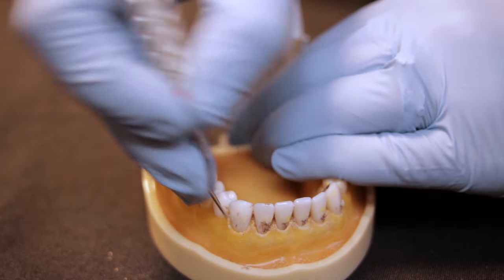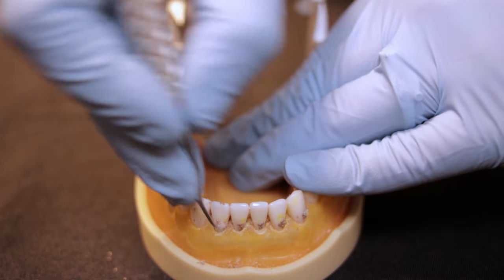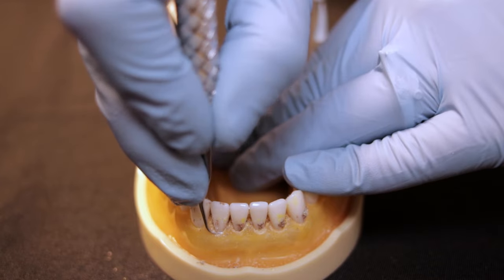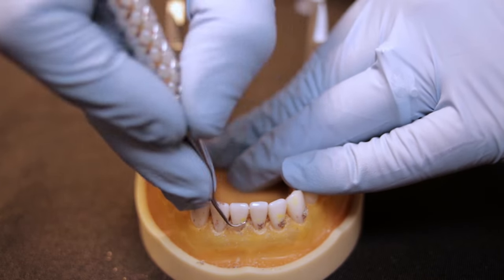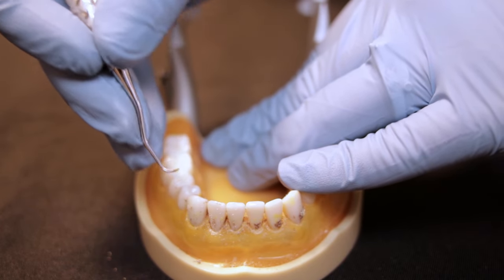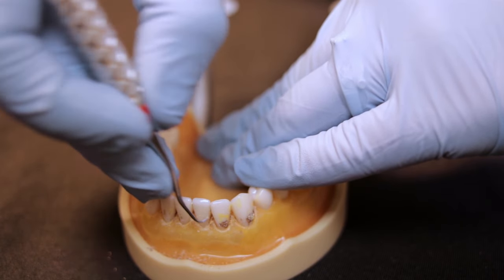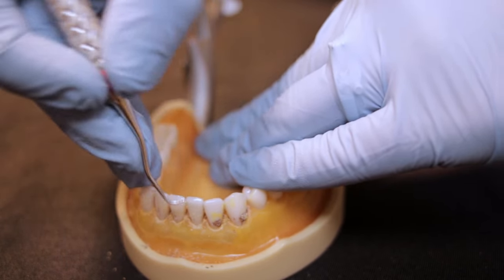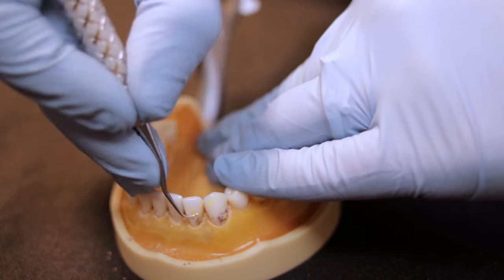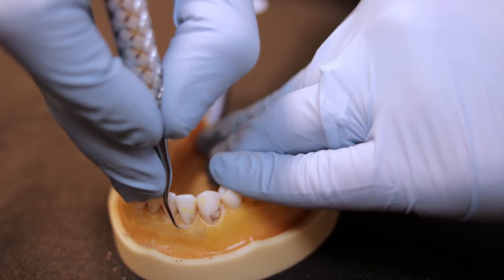Now we're going to switch and do the facial side, the away surfaces on the straight facial with the area-specific curette — the Gracie 1-2 again. With the Gracie 1-2, being area-specific means you can keep the terminal shank parallel to the tooth structure you're working on. For the straight facial, keep the terminal shank parallel with the straight facial as you go along. Nice overlapping strokes to get all that calculus and stain off — you'll commonly see a lot of stain on these lower anterior teeth from coffee or tea.